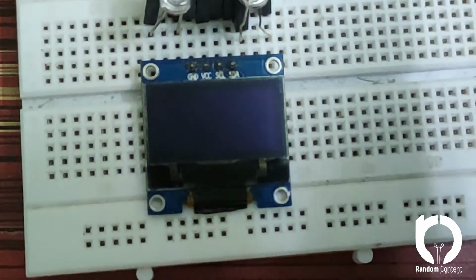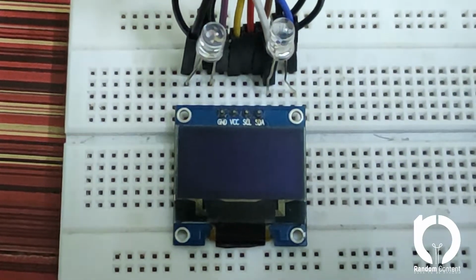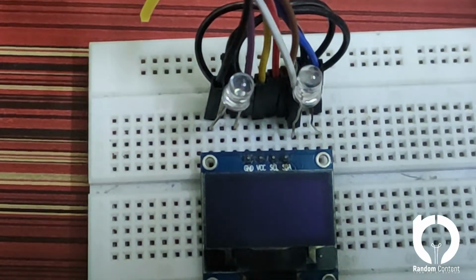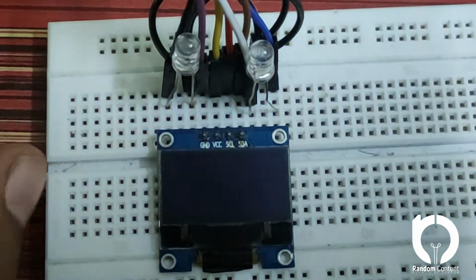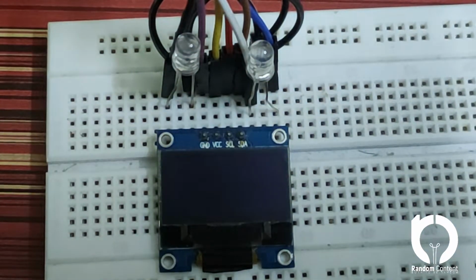Now I'll be turning on the device. Actually, my program is running on boot, so if I just power on the microprocessor, it is now powered on. In a few seconds, the program will start running, and I'll be using two LEDs for showing outputs as red or green, which means it may be anemic or it may not be anemic.